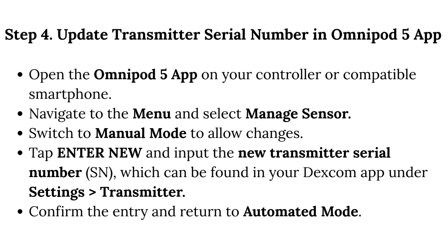Step 4: Update the transmitter serial number in the Omnipod 5 app. Open the Omnipod 5 app on your controller or compatible smartphone. Navigate to the menu and select Manage Sensor. Switch to Manual mode to allow changes. Tap Enter New and input the new transmitter serial number, which can be found in your Dexcom app under Settings > Transmitter. Confirm the entry and return to Automated mode.